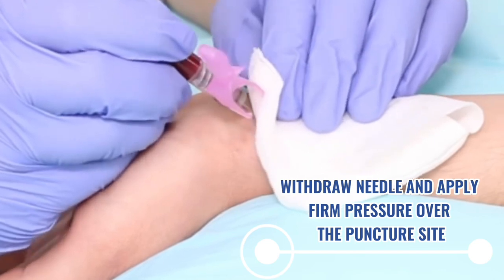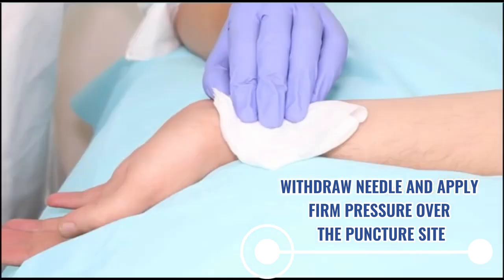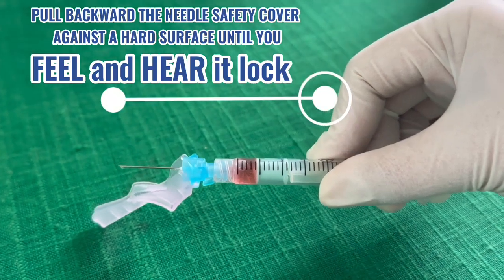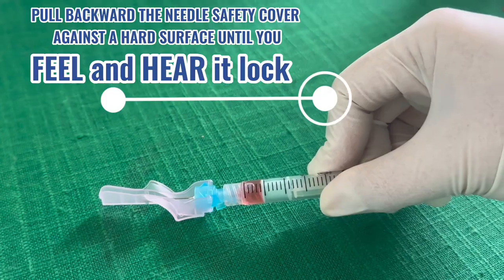Immediately apply pressure over the puncture site using a sterile gauze or cotton for one minute or more if necessary. Pull backward the needle safety cover against a hard surface until you feel and hear it lock.